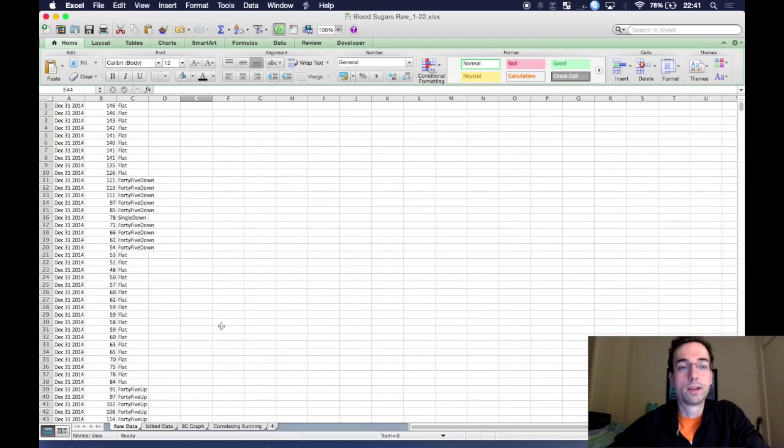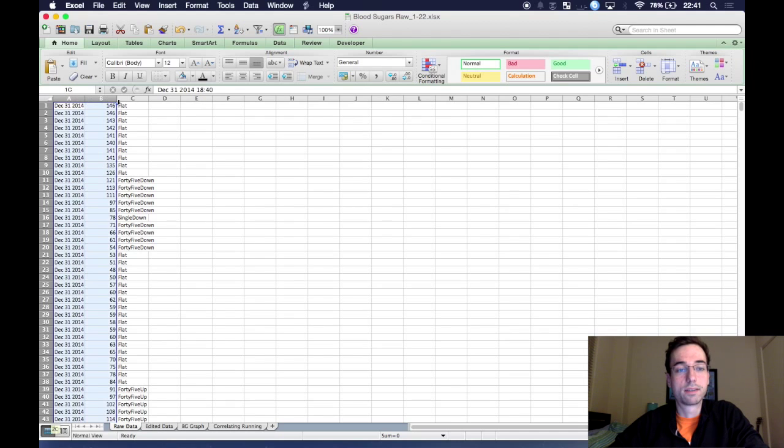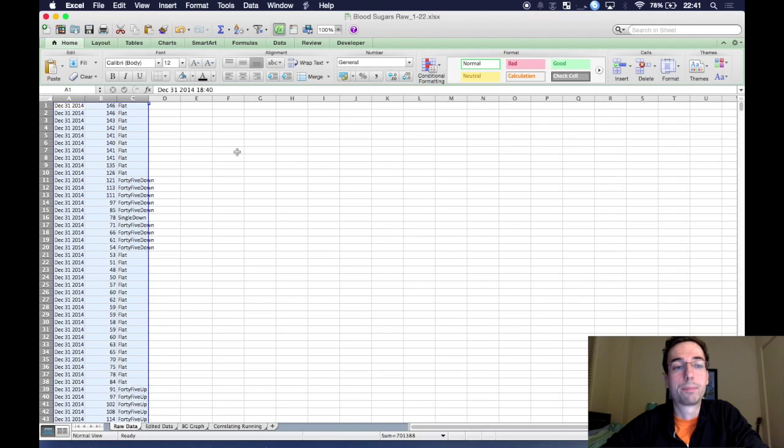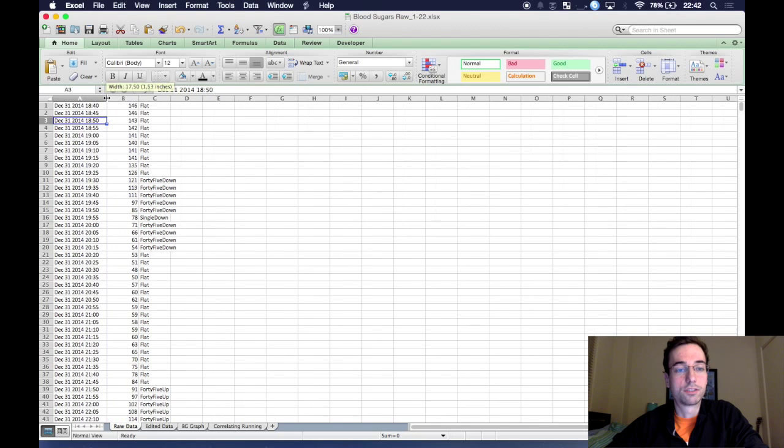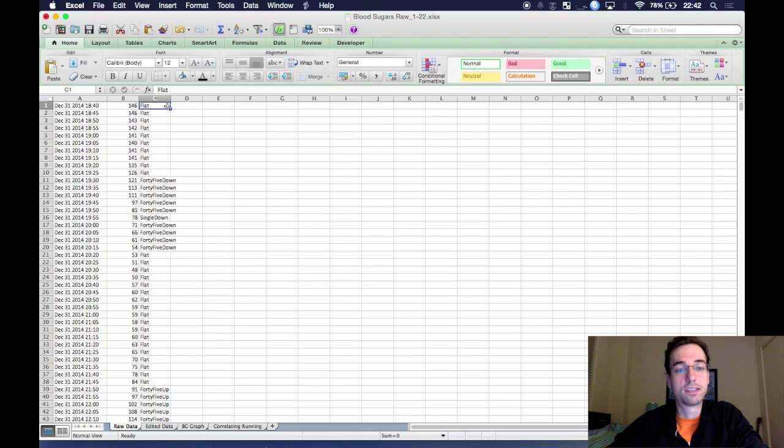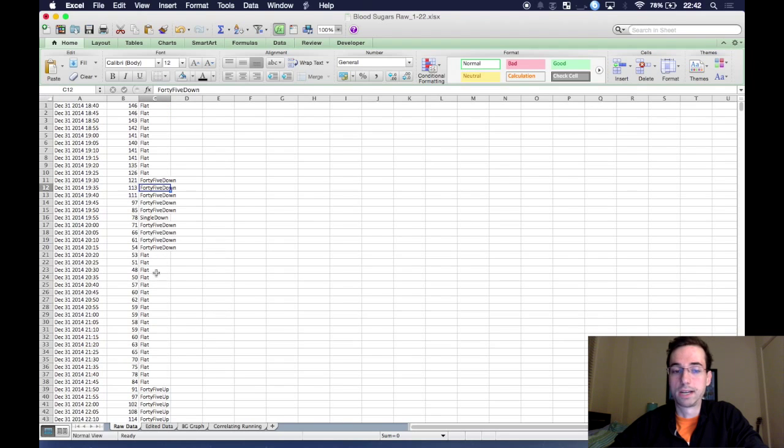Okay, so I just opened up Excel and you can see here, this is what the web app will, if you download the data from this web app, the data you'll get. So you'll see the date and you can see the date and the time. You can see your blood sugar number at that time and you can see whether the arrow is trending flat or up or down and 45 degrees or 90 degrees.